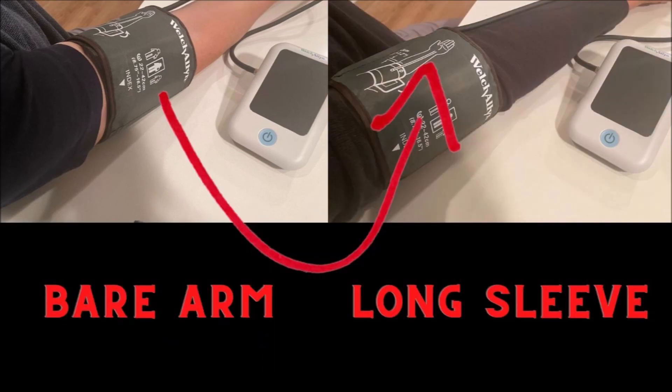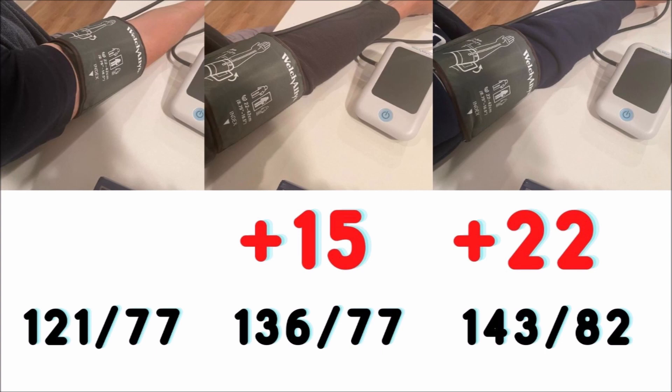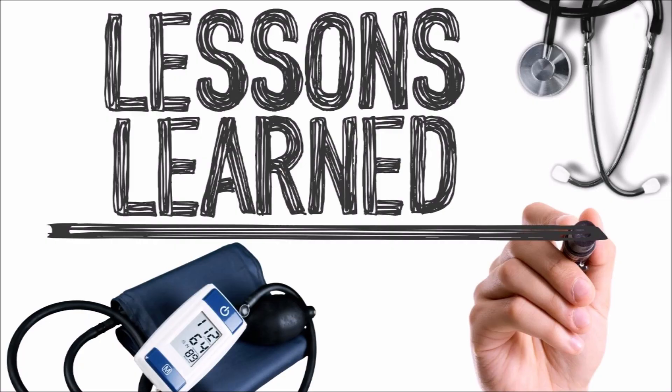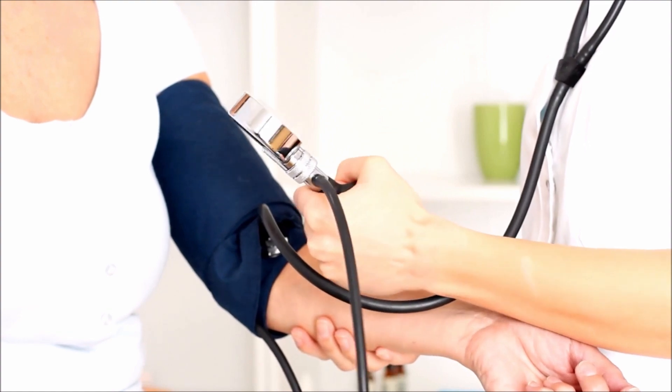Measuring with the cuff wrapped around the sleeve made a big difference, and it increased every time the thickness of the sleeve increased. Interestingly, it read my pulse the same for each one even though the pressure increased. This is a huge lesson: the next time you visit a doctor or measure your pressure at home, make sure you have a short sleeve shirt on so you can find out your real blood pressure reading.